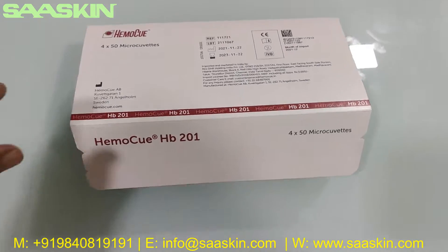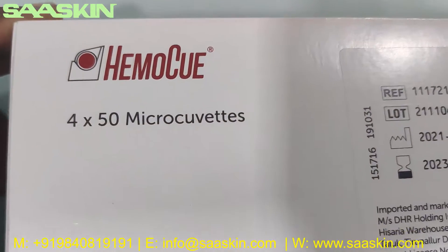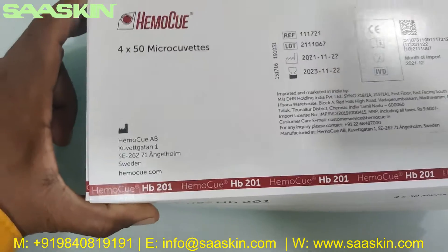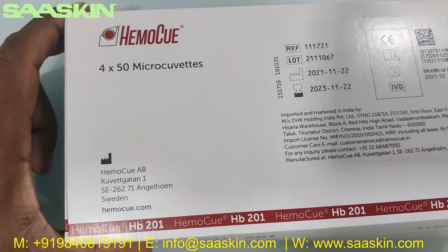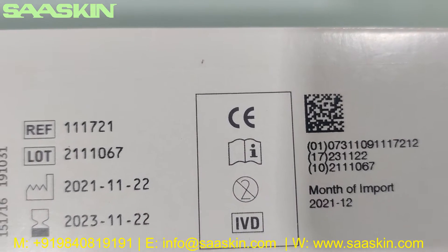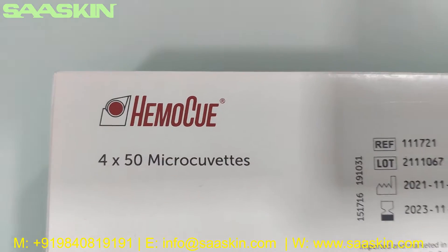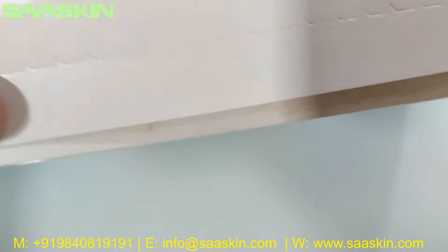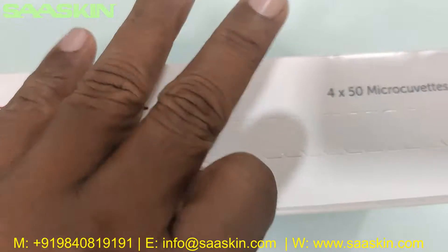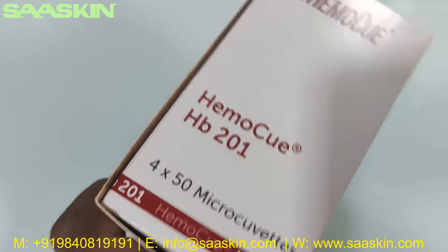Hello everybody, today we're going to see the unboxing of HemoQ micro cuvettes. These are the cartridges from HemoQ Sweden. You can see this is a certified product — on the standard you have a two-year expiry period. This is the HemoQ HP 201 micro cuvettes, a patented technology for hemoglobin testing.